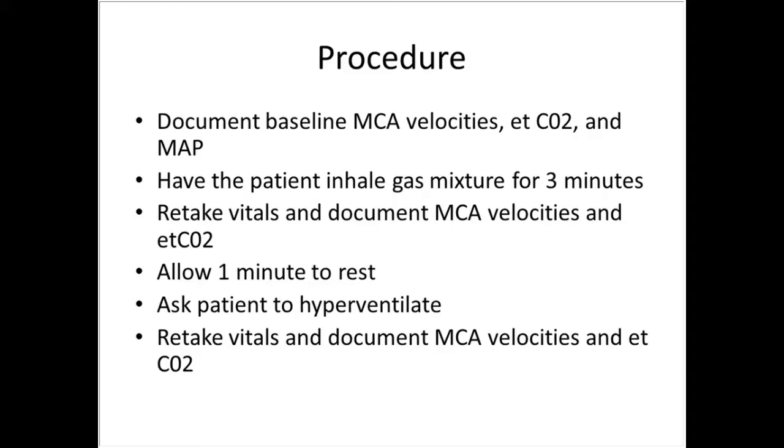So we'll document the baseline MCA velocities, end-tidal CO2, and mean arterial pressure. We have the patient inhale the gas mixture for 3 minutes, and then we retake vitals and document again MCA flow velocities and end-tidal. And we give them about a minute to rest and kind of catch their breath.